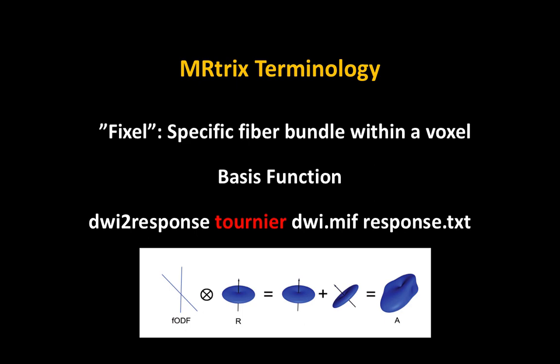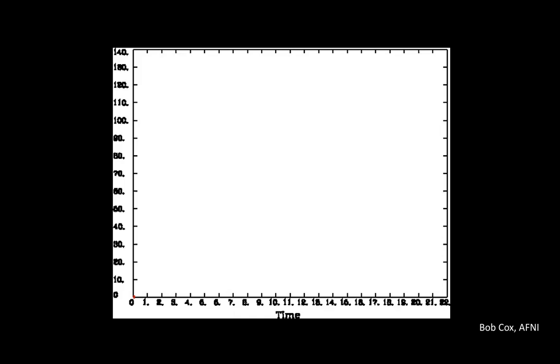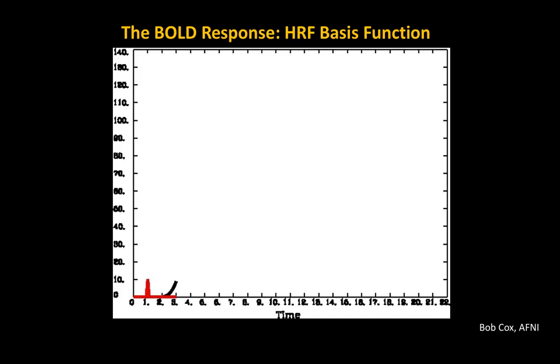If I'm looking at your auditory cortex, obviously we know that the auditory cortex is responsive to auditory stimuli. That seems to be what it processes. And with fMRI data, we're looking at something called the hemodynamic response function. That's a stereotyped response of these voxels we're measuring signal from. Right? So how the blood flow should play out over time. Again, it's not always a perfect representation, but it's a pretty good model, so we use it quite a bit. So if I give you a stimulus, represented right here, it's a punctate instantaneous function, we should get something looking like this for the hemodynamic response. There's blood flow that comes in, it increases the signal, it decays over time, and if we had fine enough resolution, we would assume that it looked something like that.